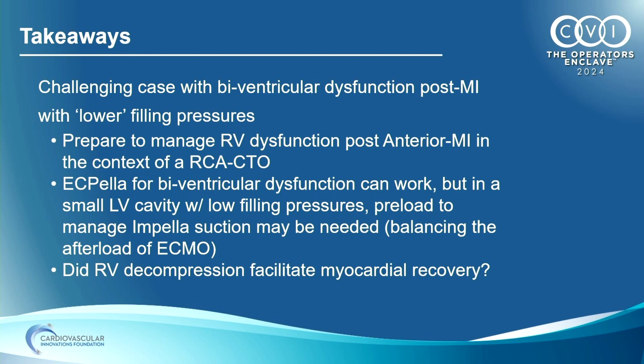And I think it's up to dealer's choice and arguments as to how every institution prefers to manage these patients. But in this case, we went with ECPella versus a bipella support option for this patient, balancing the discussions that we had earlier today about how we unload a patient with ECMO, whether full support with unloading with 4 liters per minute is truly unloading the patient versus doing an Impella, especially in a patient who just had an anterior MI and you're thinking, hey, maybe we should rest the LV so that we can have recovery when we're turning up ECMO flow so high. So I think that's something that's still open to debate and controversial.